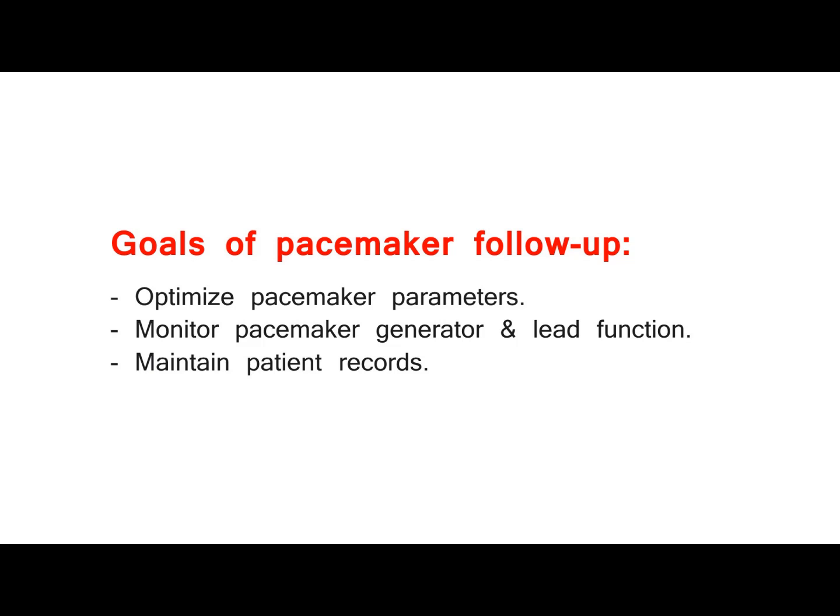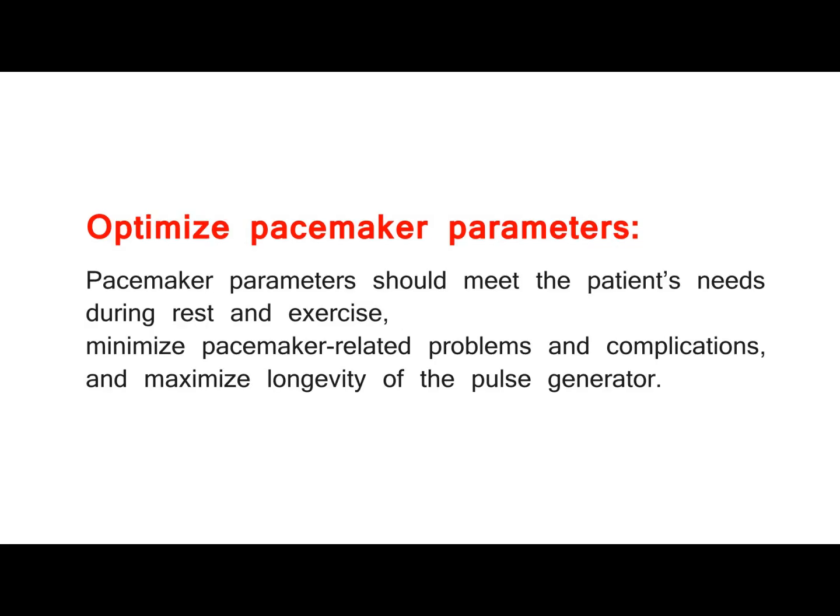Optimize pacemaker parameters. Monitor pacemaker generator and lead function. Maintain patient records. Optimize pacemaker parameters. Pacemaker parameters should meet the patient's needs during rest and exercise. Minimize pacemaker-related problems and complications.